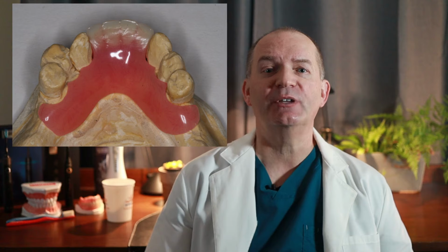It was called a flipper because the traditional ones were just basically a denture tooth with some hard acrylic. The hard acrylic wrapped around the back of the teeth next to the space, but the whole thing could be flipped in and out of your mouth with your tongue. This type of flipper is designed to be used just for looks and isn't meant to be used for eating. Even if wire clips were added to the hard plastic flipper, it doesn't stay in very well.